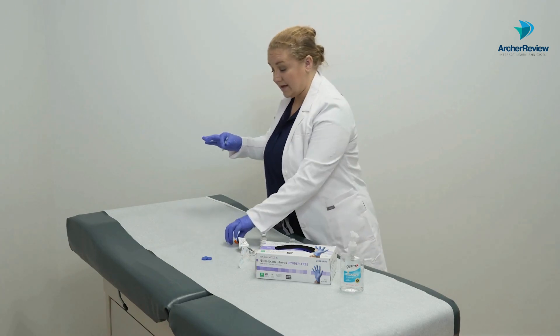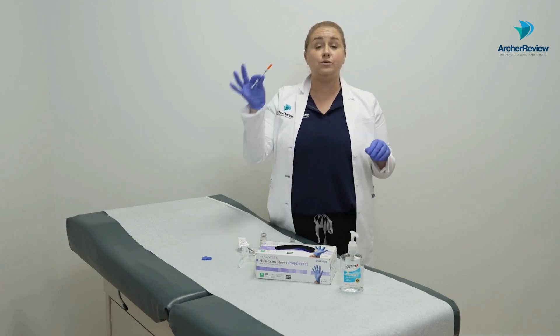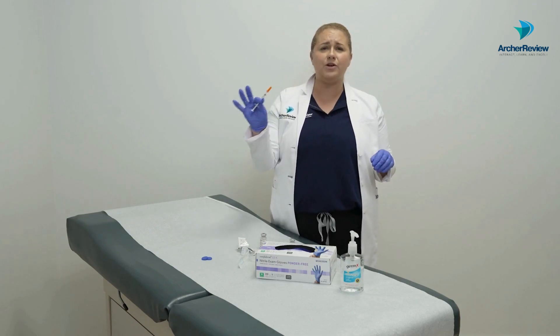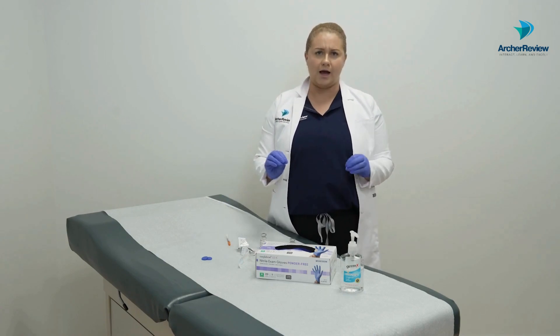We'll go ahead and place the cap on the syringe. If we're preparing this outside of the client's room, we need to label it with the date and time so we know exactly what it is, then go ahead and immediately administer it to our client.